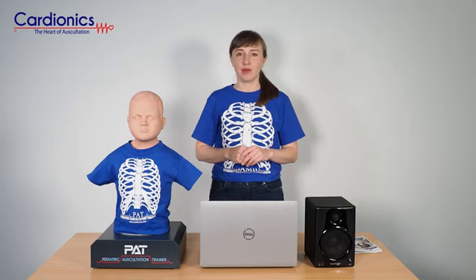Welcome to this PAT out-of-the-box video. PAT comes with the following components and gives you a complete solution to your pediatric auscultation training. Once you unbox your PAT, you'll find the following.